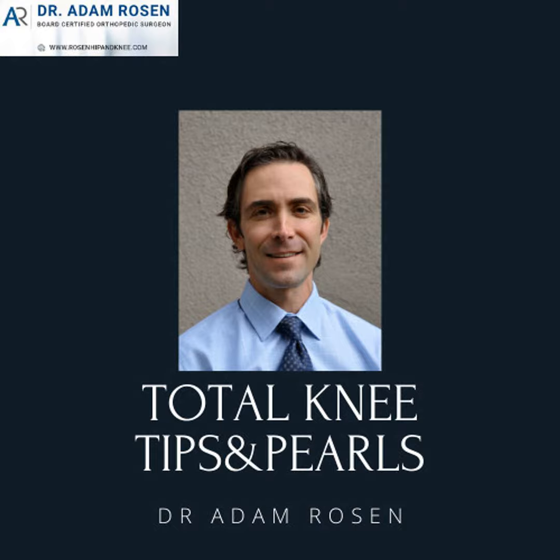For knee x-rays, in patients over 50 we typically get 4 views, and I'll describe it as we have a weight-bearing AP, a Rosenberg, a lateral, and a merchant view, or maybe you prefer to get a sunrise view. But you describe, okay, these are the views that we have. Why is that important? First of all, I'm making sure, are these weight-bearing x-rays? Because an AP supine view is not as important, and it explains a different picture. So it also makes sure that you capture that information.